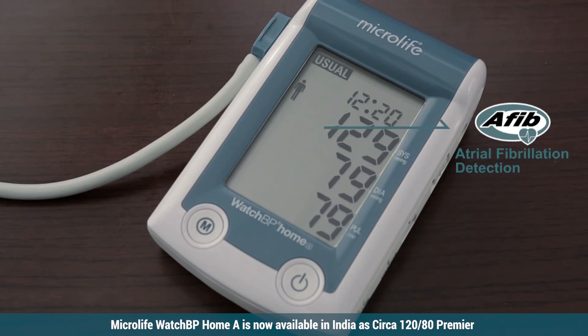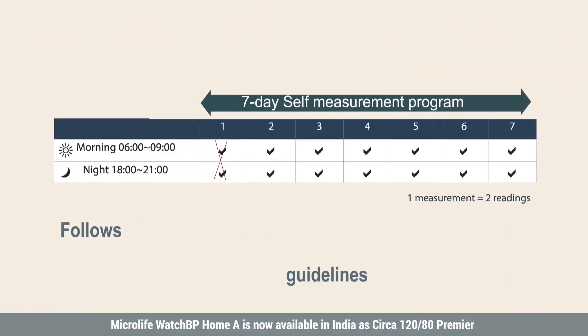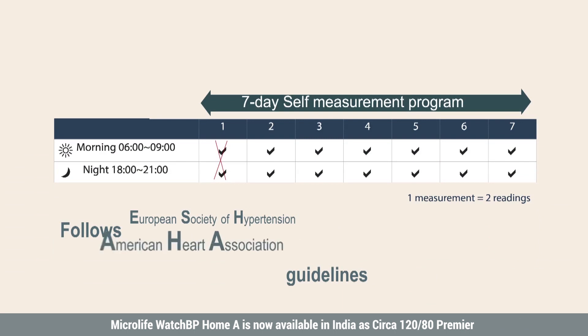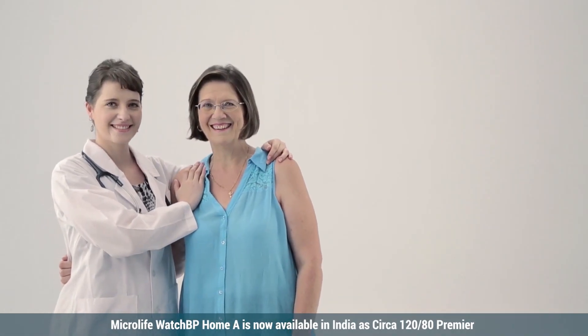MicroLife WatchBP Home A also has an embedded 7-day self-measurement program that strictly follows European Society of Hypertension, American Heart Association, and British Hypertension Society guidelines. MicroLife WatchBP Home A is your best choice for stroke prevention.